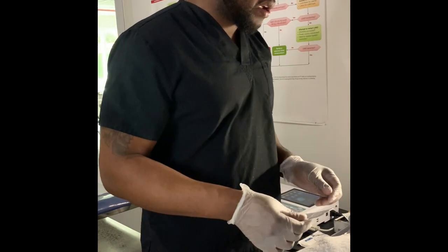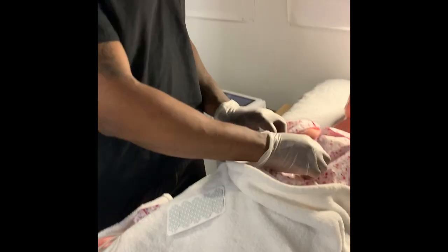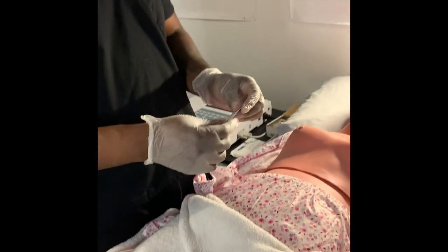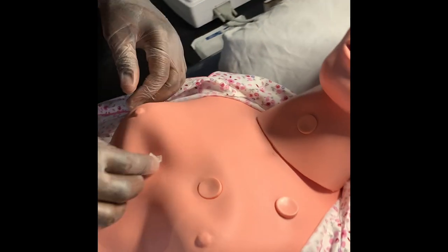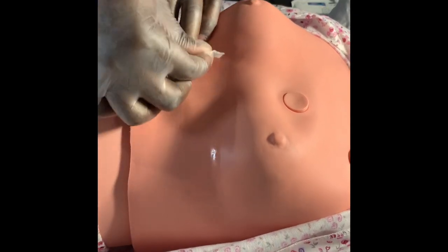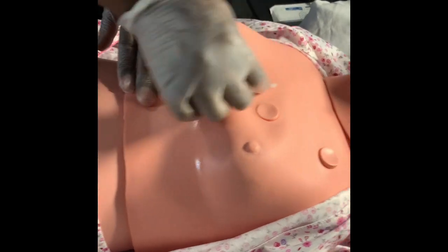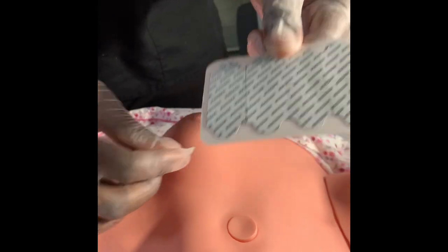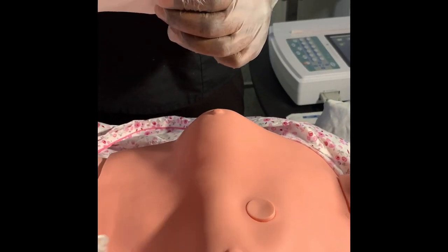When you start off your EKG, you want to make sure that you have your electrodes ready. Now that my patient is exposed, I'm going to go ahead and wipe the patient down with some alcohol wipes. The reason I'm wiping the patient down is in case they have any oil, lotion, or sweat — that would make it really hard for the electrodes to stick on the patient's skin.